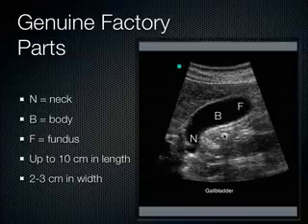And so, when you're looking directly at the gallbladder, as you get to the edge, as you're fanning through any organ, some of that sound starts to get into the organ next door, and it overlays that organ on top of the organ you think you're looking at. That's why some people can easily mistake it: if they get up to the edge of the gallbladder, the air in the duodenum suddenly looks like it's superimposed over the gallbladder. That's how a mistake can be made, and you say, oh, there's a gallstone, when in reality it was just some air in the duodenum.